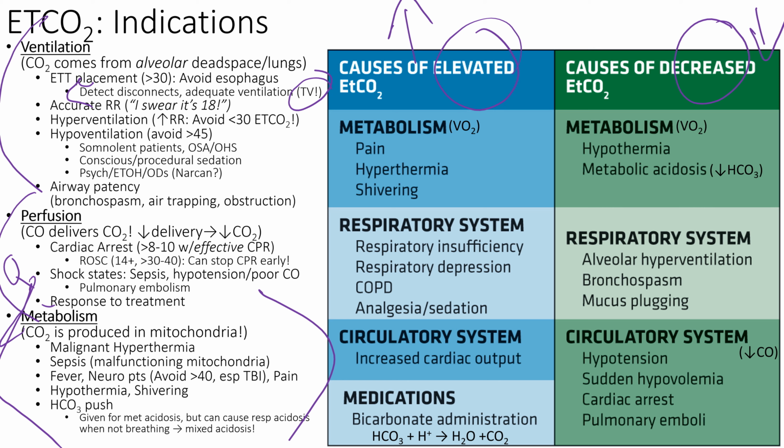So who might be at risk for hypoventilation that should have the end-tidal CO2 that's not extubated? One of these guys here. Over-medicated. It could be over-medicated, someone getting like a PCA pump. This is kind of why PCA pumps are discouraged, but also someone that is post-procedure, right? Any post-procedure patient needs to have end-tidal CO2, right? Any bedside procedure, definitely. In the PACU, they measure this for recovery. So you want to see if their end-tidal CO2 starts climbing. That means they're not breathing, right? Post-anesthesia gas or post-propofol infusion or post-Versed for conscious sedation.